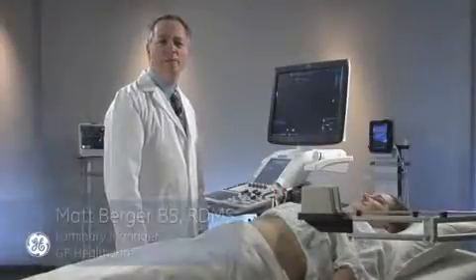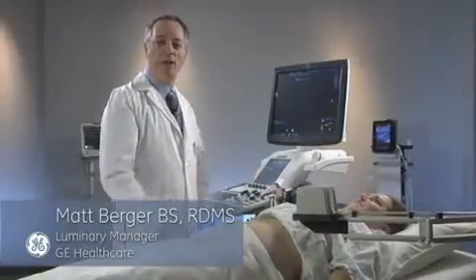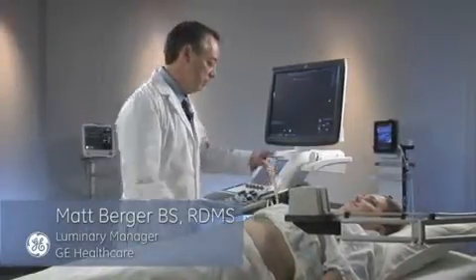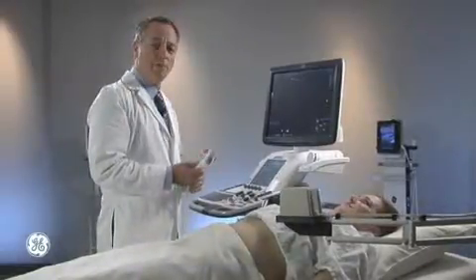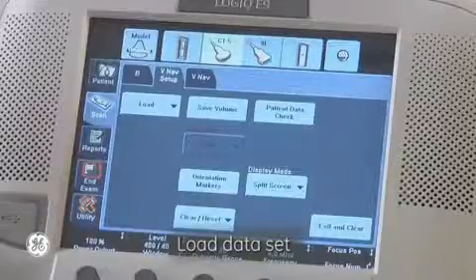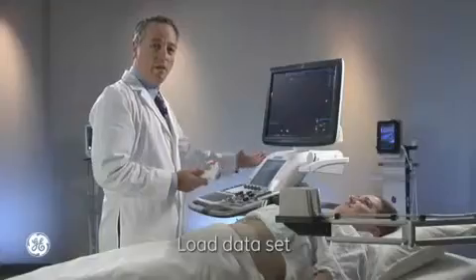Now that we've completed the setup of volume navigation and our patient has arrived, let's begin the study. With volume navigation already activated, my first step is going to be to load my data set. To do that, I'm going to select the load on the touch panel.